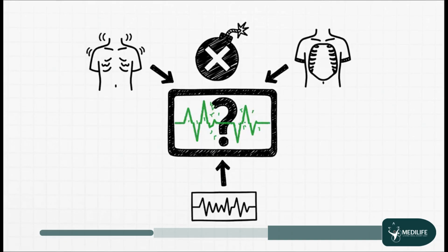But, and this is a big but, SVV isn't perfect. It's only accurate under very specific circumstances. If the patient is taking their own breaths, if their chest is open after surgery, or if they have an irregular heart rhythm like AFib, that number becomes totally unreliable. You always have to know the limitations of your tools.